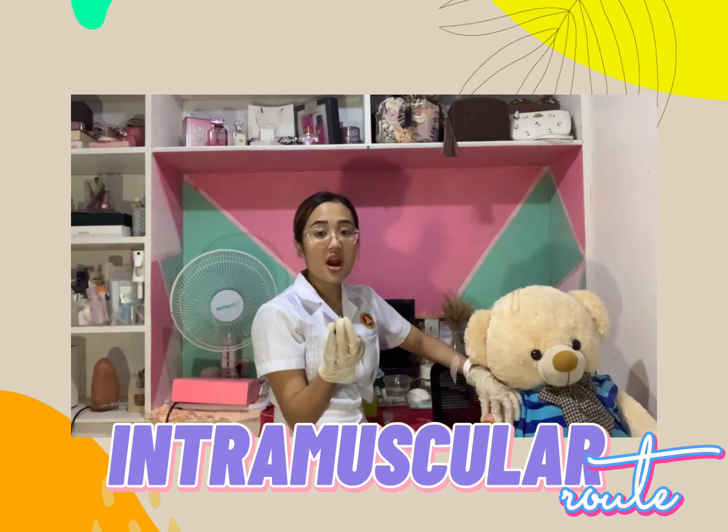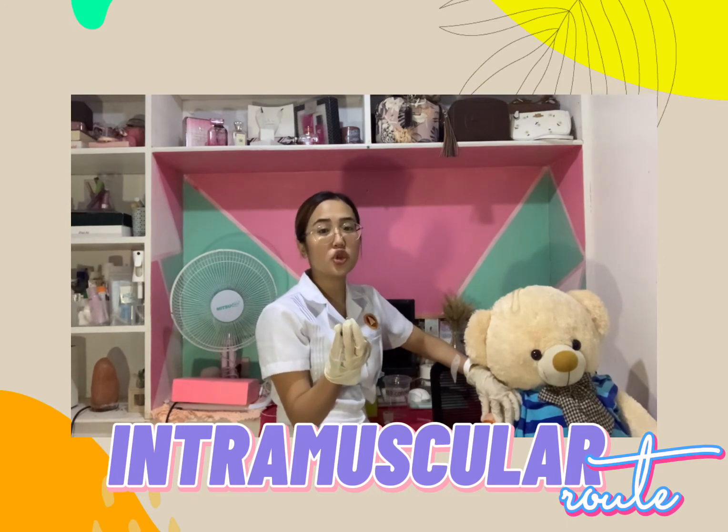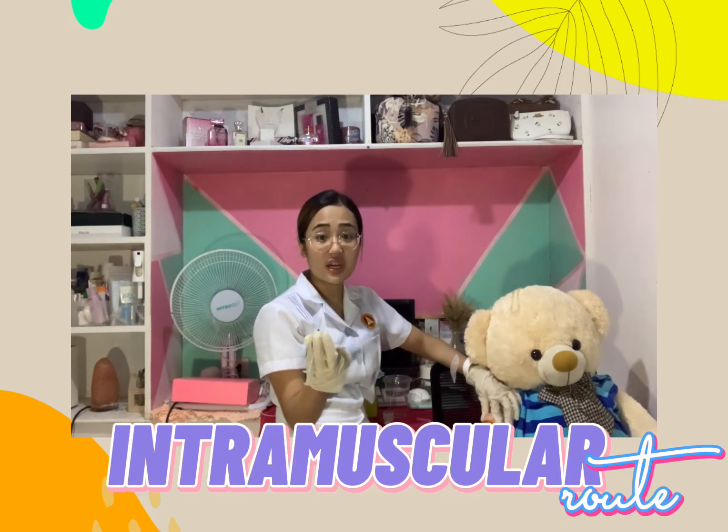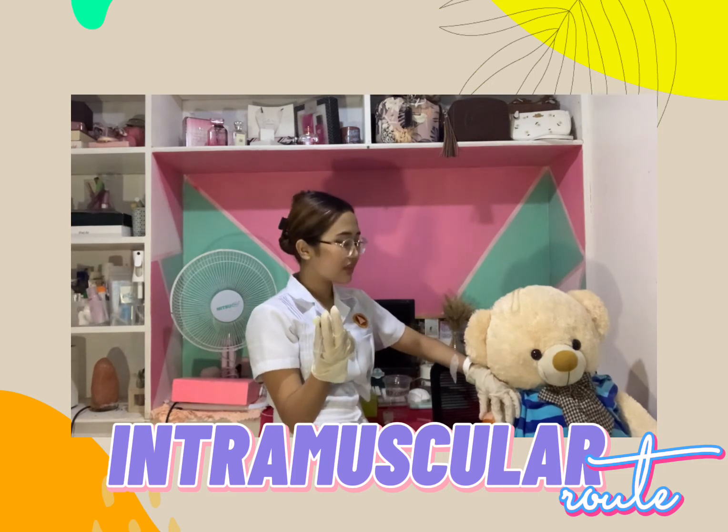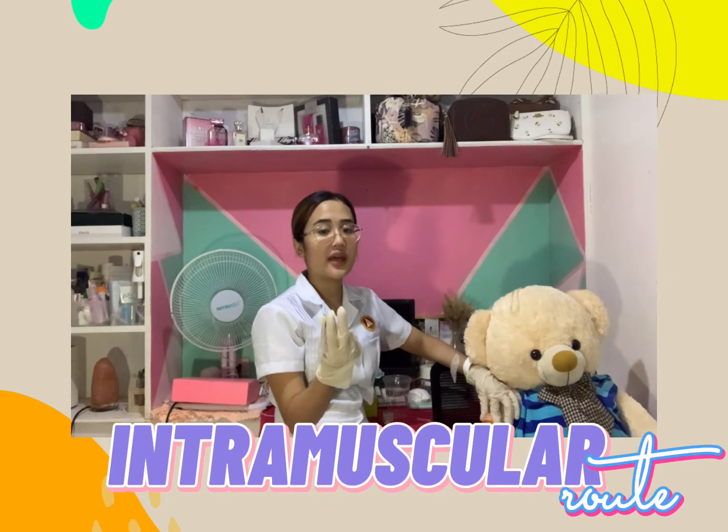And if there is aspirated blood, you need to make sure to remove the syringe, discard it and replace it. Do the sterile technique again, and then perform it in another side or another site. However, if there is no aspirated blood, you can slowly administer it.